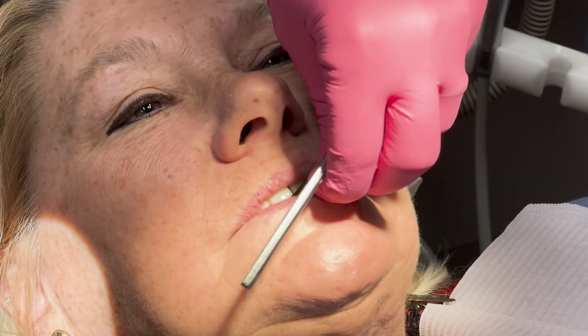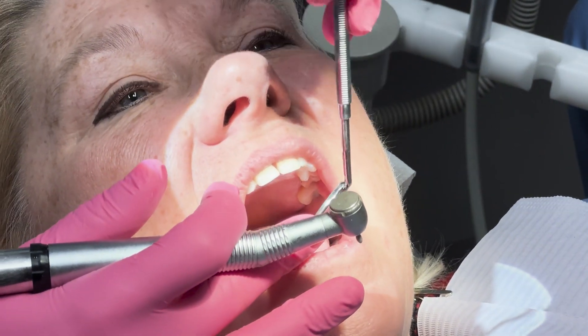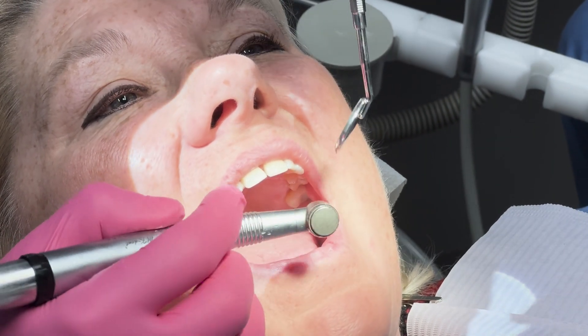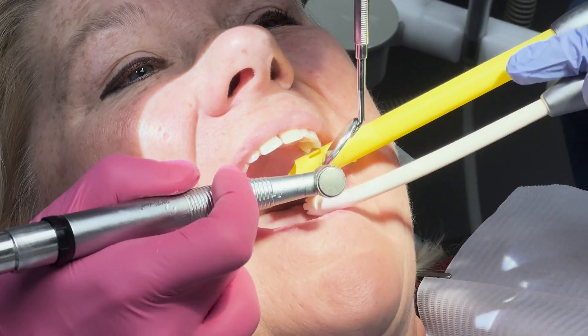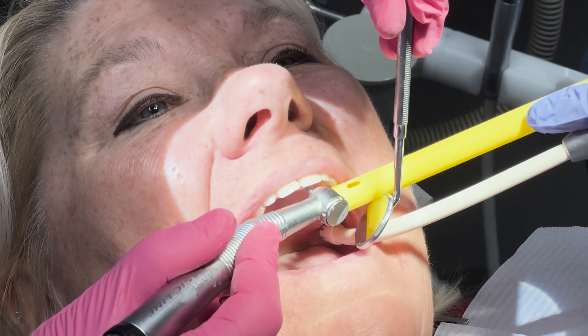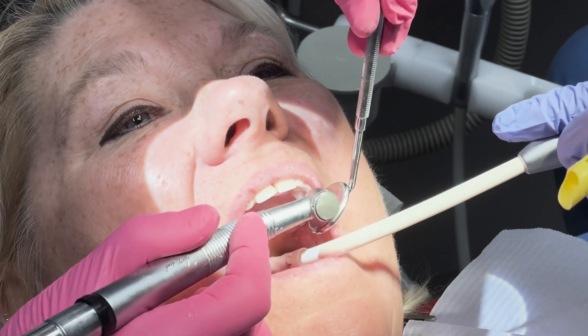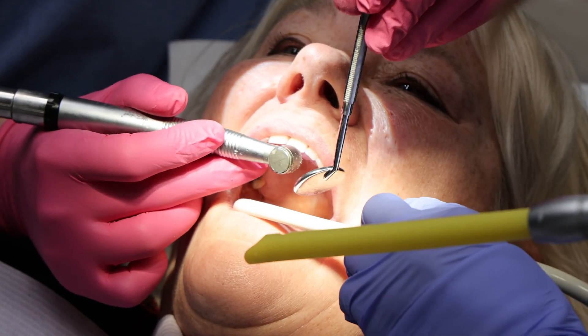Little adjustment, okay. Back to the water. Try that for me - better, worse, same? Better. Better, still feel it? And bite, bite and hold it, and open. I can still do more, but is it improving each time? Yeah. Okay, good.